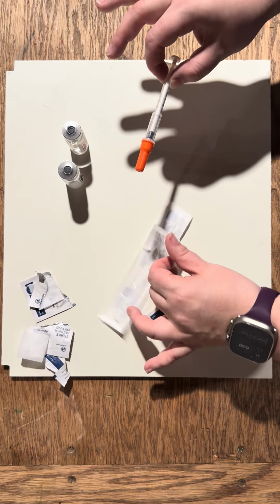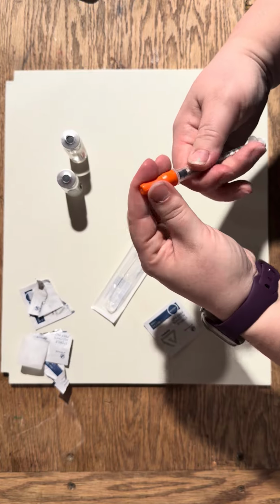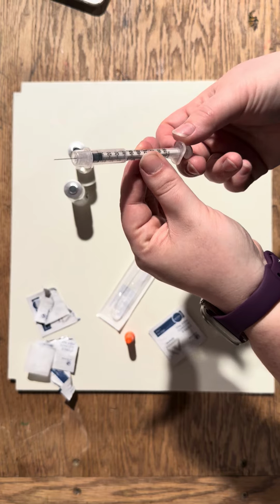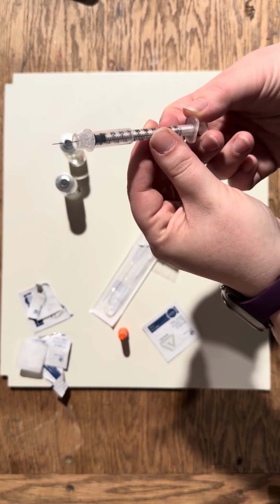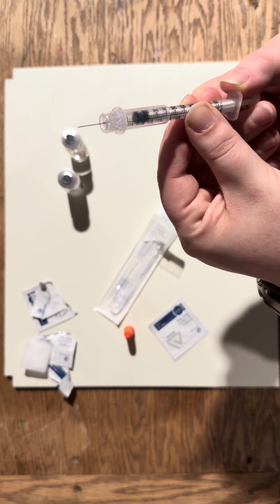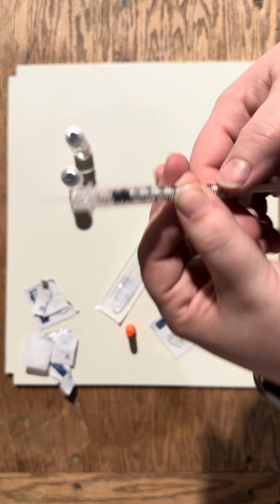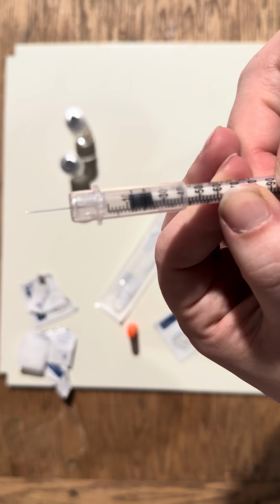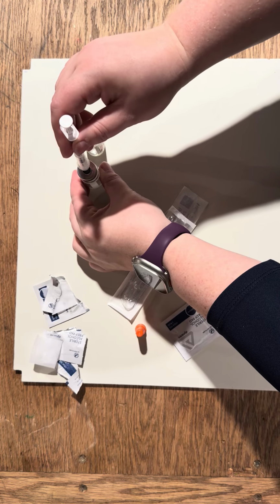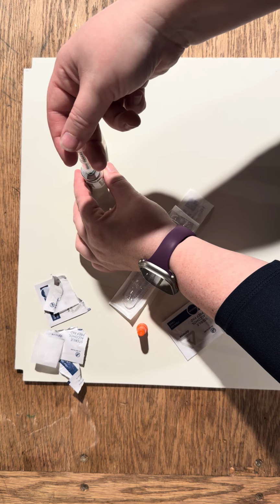I will take off the cap, and I will first pull out to 12, pulling air into the syringe. 11, 12. As you can see, I have 12 of air. And that will go into the NPH, not touching the solution, just enough to inject the air in.